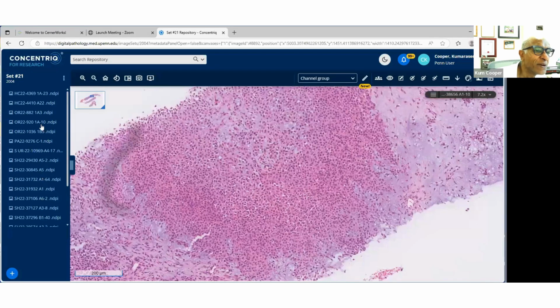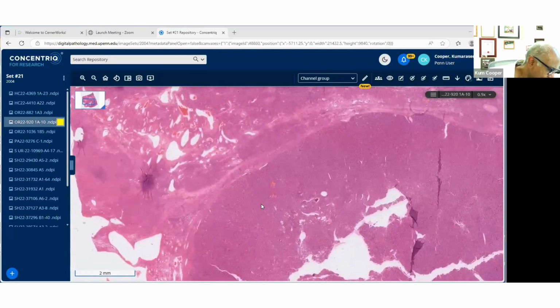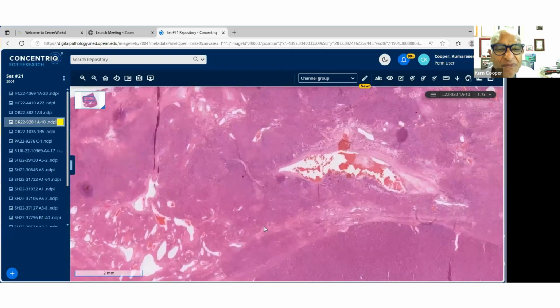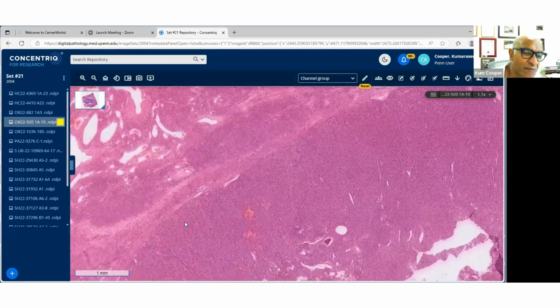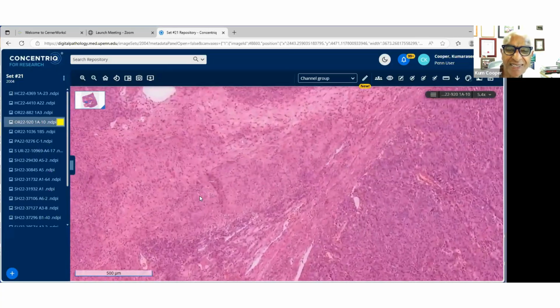920. Here we go. Let me just close the chat so you can all see this. So this is a pelvic mass. I don't have a size for you. Patient is a 75-year-old woman, and I do not have a size. I apologize, but a pelvic mass it is. And this is a section from that pelvic mass. Just trying to determine where we are.